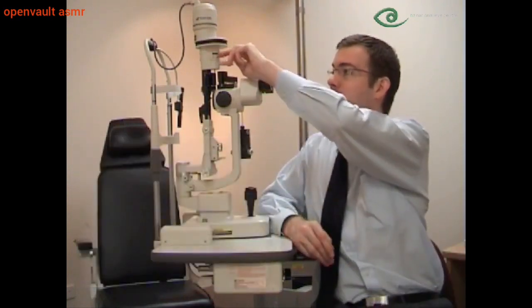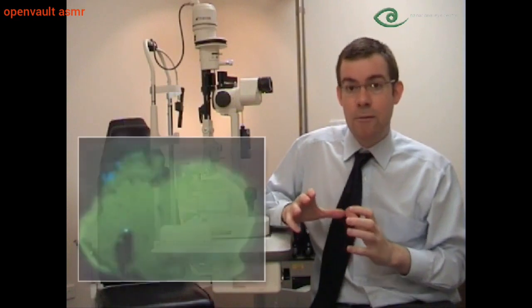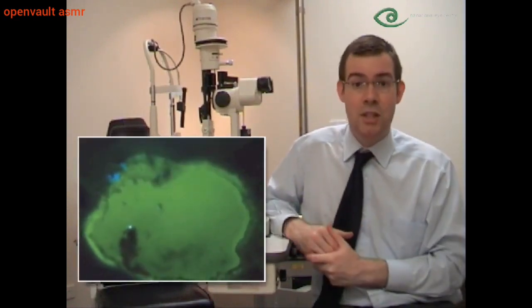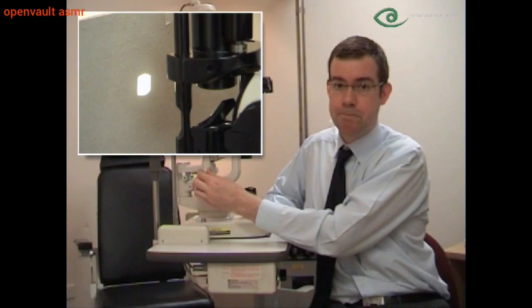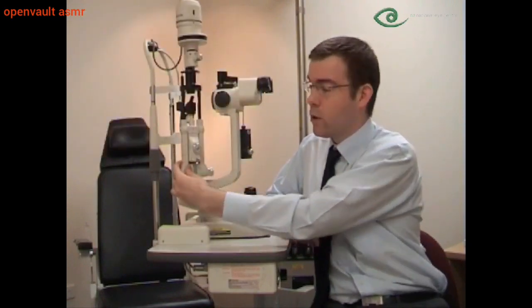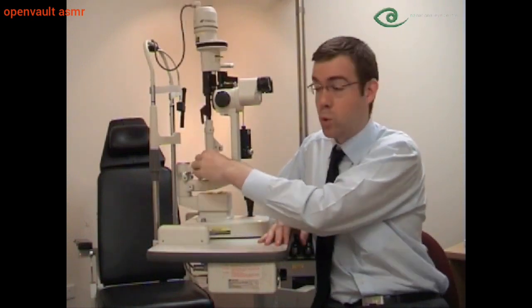In most slit lamps, rotating this dial all the way to the left will give you a cobalt blue filter. And under this light, fluorescein dye will fluoresce green, which is useful for visualization of epithelial defects. We can adjust the width of the beam with this knob. You can also alter the orientation of the slit lamp by moving the entire illumination system to the left or to the right.